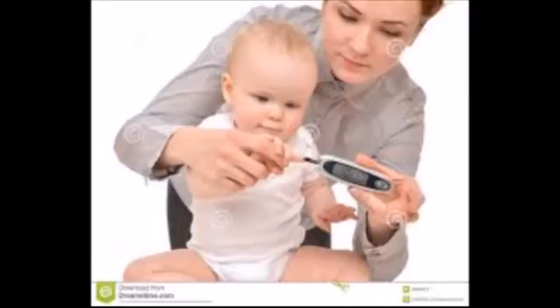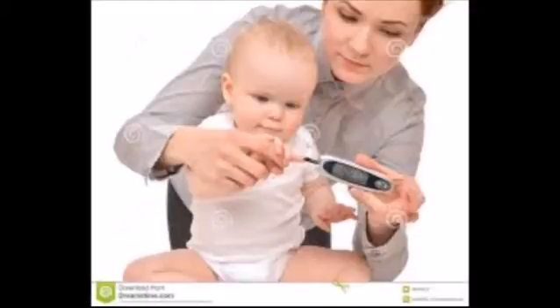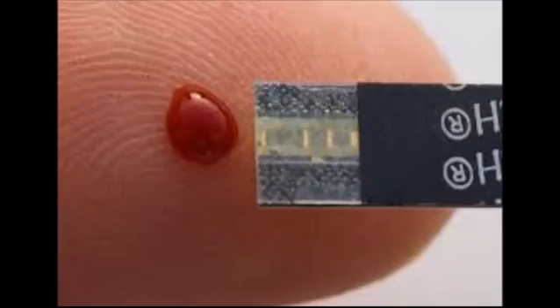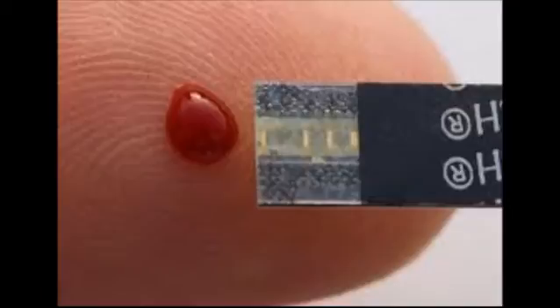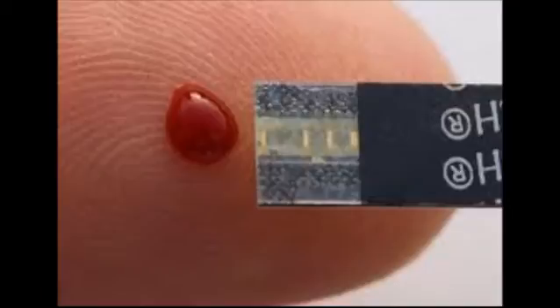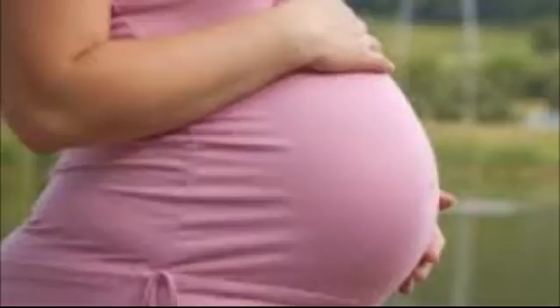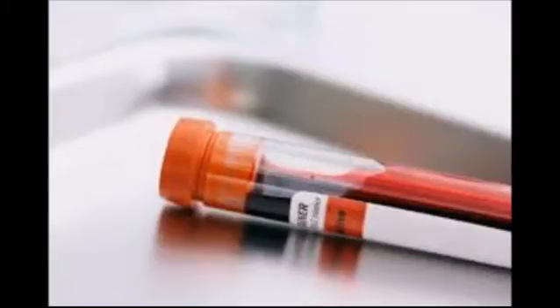Patients with advanced-stage diabetes or pregnant women need a greater number of glucose readings per day. Nowadays, small children also have diabetes, and for each glucose reading they have to face the pain of a needle. Nobody wants the pain of a needle. Some devices available in the market take a smaller blood sample, but pain is still there. There is a need to develop a non-invasive monitoring system which can measure blood glucose continuously without much problem.